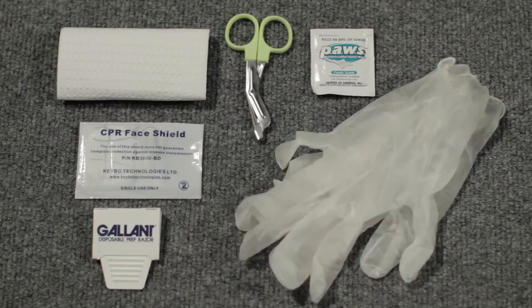In a real rescue, you would use all these items if needed. For training purposes, we won't use them in this exercise.